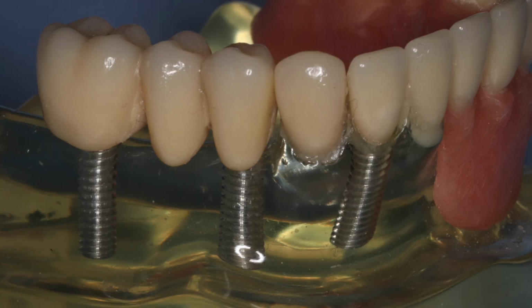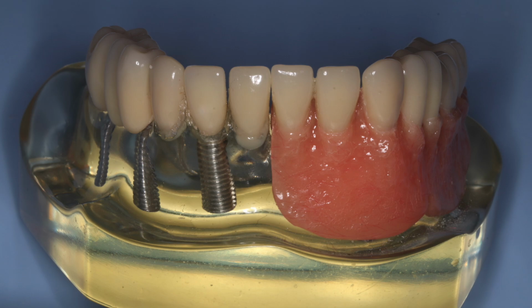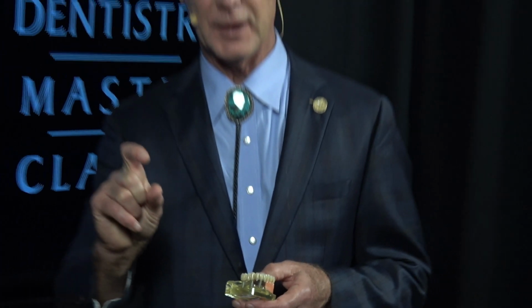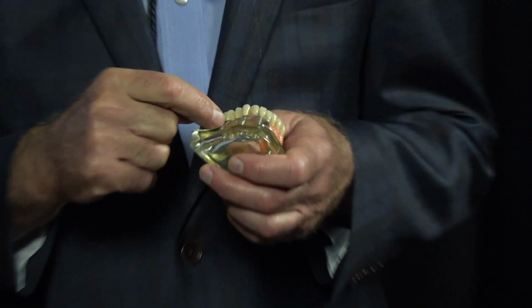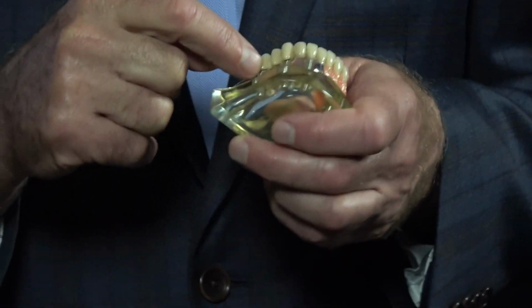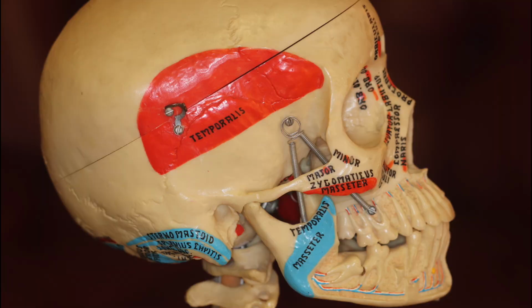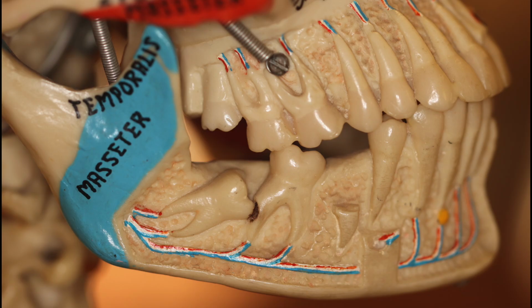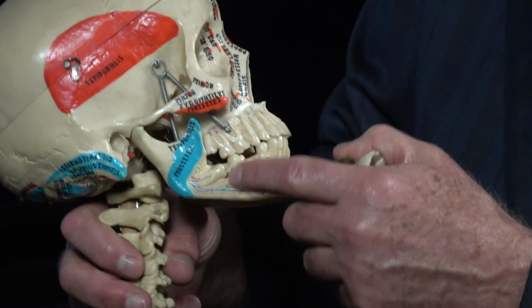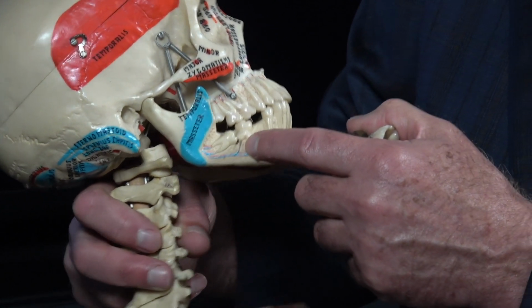Or you can place an implant if you have enough vertical bone height for an implant. Now, what do I mean by that? That means if there's enough space between the top of the bone or the alveolar crest and the nerve, this nerve right here in the posterior part of the lower jaw or the mandible, if you have enough vertical space here, you can place an implant.